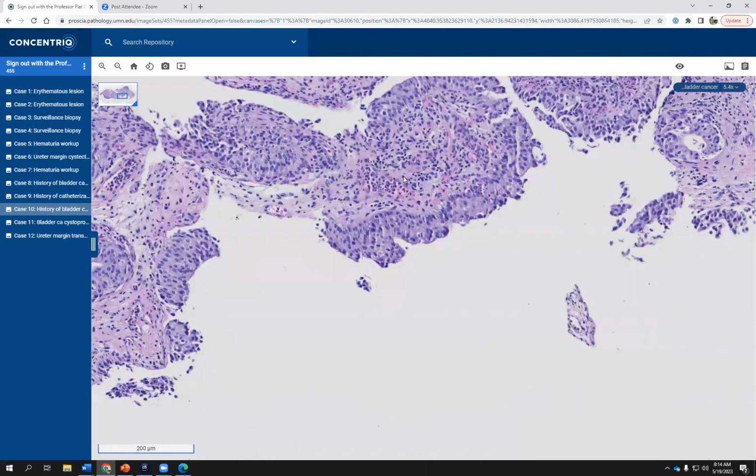I use atypia favor reactive, atypia favor carcinoma in situ, and in some cases, you just cannot make the difference. You could just leave it as atypia, but I would warn you to use the term atypia without qualification very sparingly, because if you start using it for a lot of cases, then the urologist is going to lose confidence in your diagnostic ability, right?